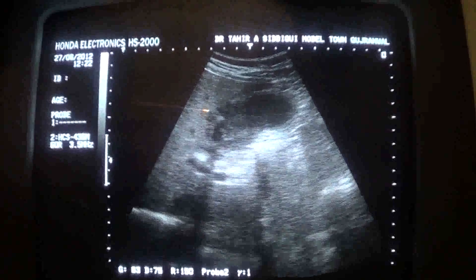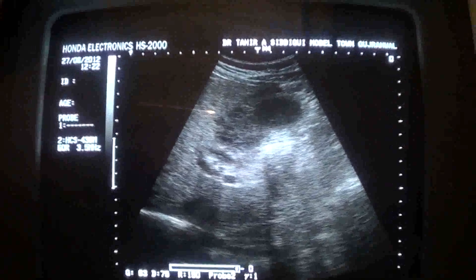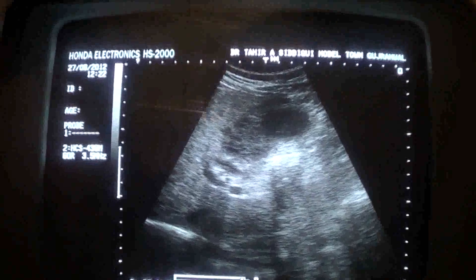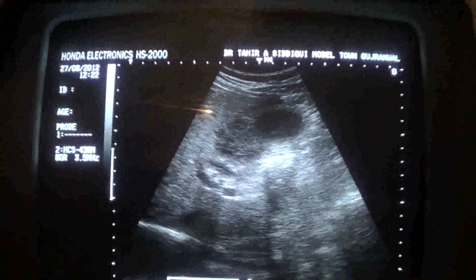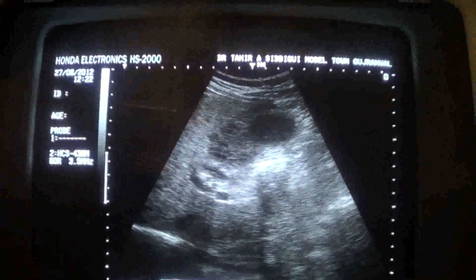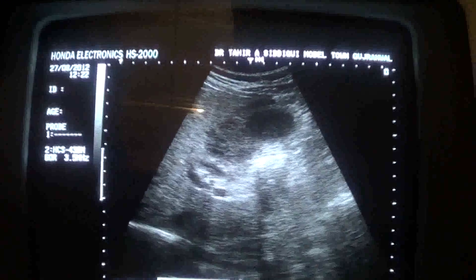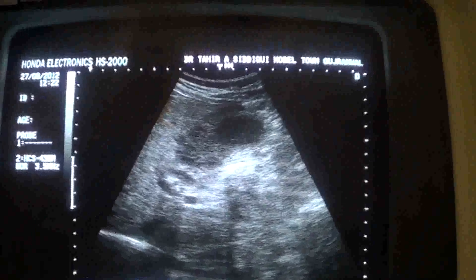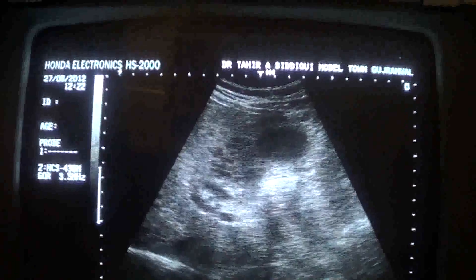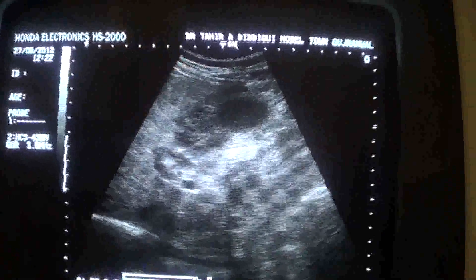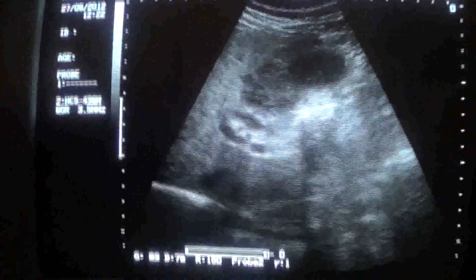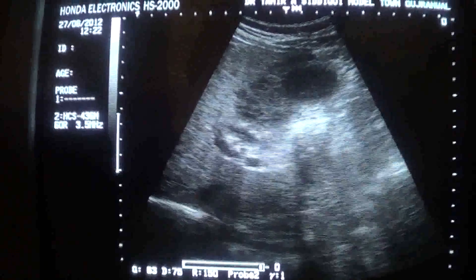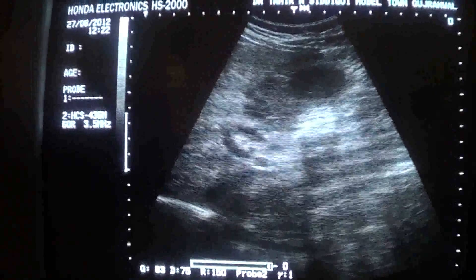The only finding relates to the gallbladder, consistent with gallbladder calculi with sludge, thick walls, acute pericholecystitis, and impending mucocele rather than mucocele of the gallbladder — as the gallbladder is not distended. So I am saying impending mucocele. Thank you.